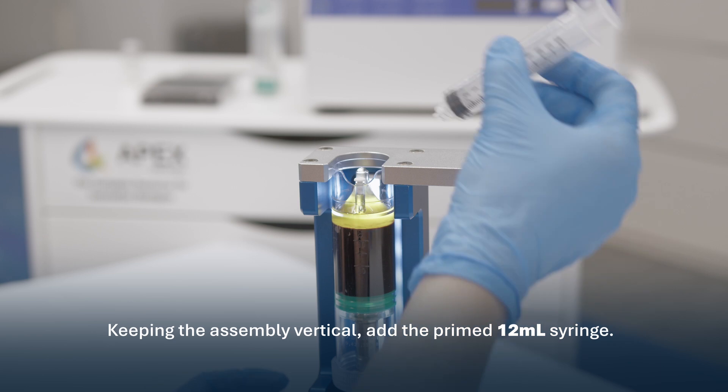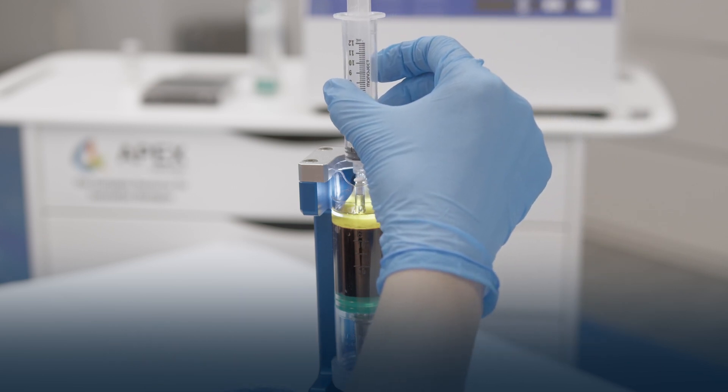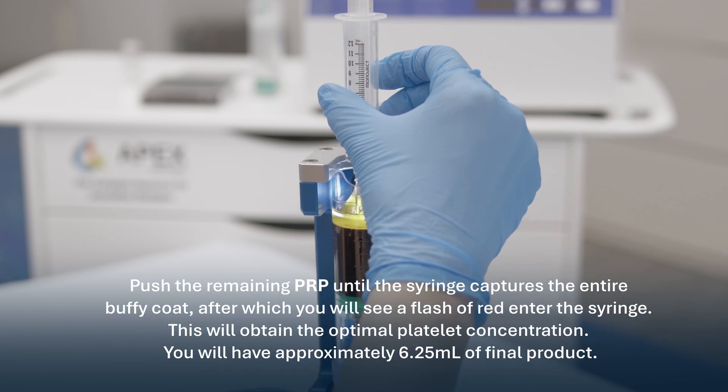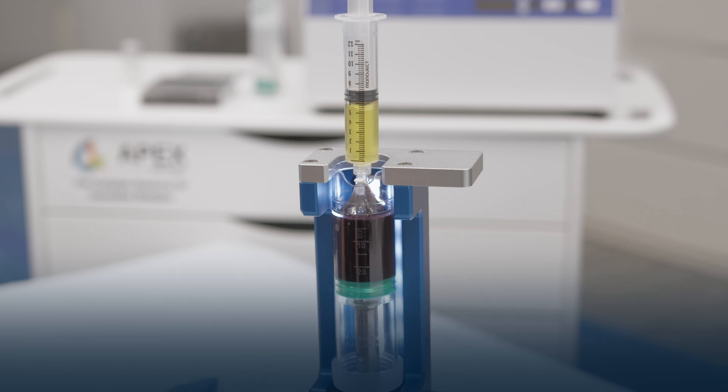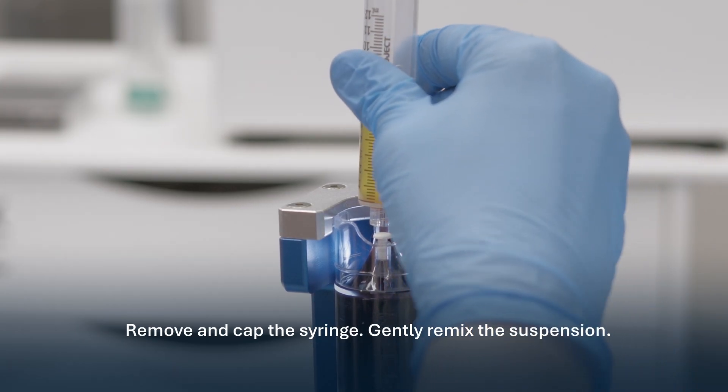Keeping the assembly vertical, add the primed 12 milliliter syringe. Push the remaining PRP until the syringe captures the entire Buffy coat, after which you will see a flash of red enter the syringe. This will obtain the optimal platelet concentration. You will have approximately 6.25 milliliters of final product. Remove and cap the syringe. Gently remix the suspension.